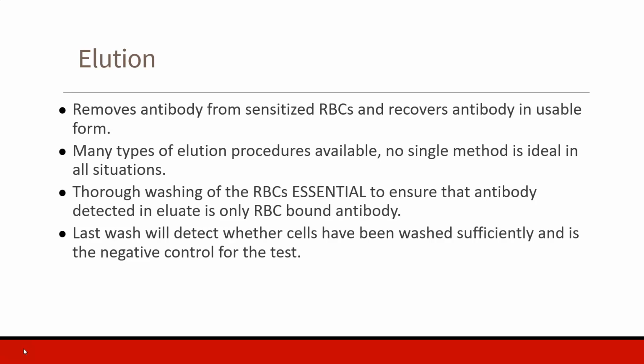Thorough washing of the red cells is essential to ensure that antibody detected in the eluate is only red cell bound antibody. So let me give you an example. We had a patient with a really acute autoimmune hemolytic anemia, and she was chronic. So there would be times that she would be on heavy-duty steroids to suppress that immune response, and then she'd go along, and all of a sudden she'd go into crisis where she massively produced this autoantibody. So we were real used to her because we've dealt with her for years.